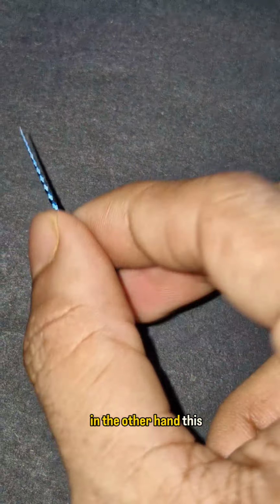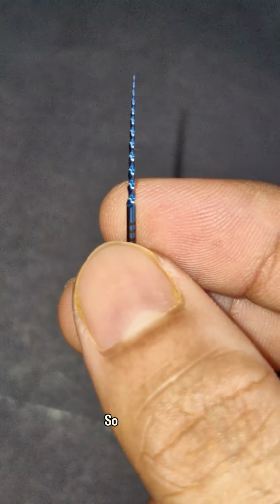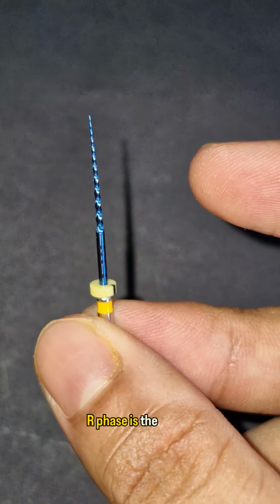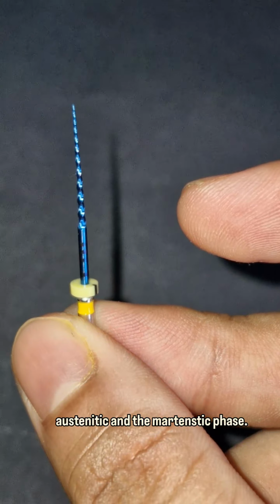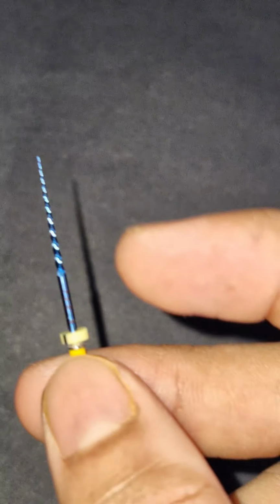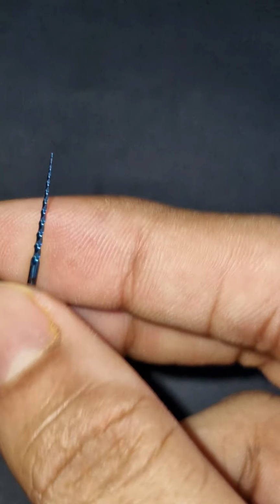Now on the other hand, this is your third generation rotary file. So this is basically based on the R phase technology. So what is R phase? R phase is the in-between phase between the austenitic and the martensitic phase. So the main difference between the third generation and the second generation rotary system is that this can be pre-curved.